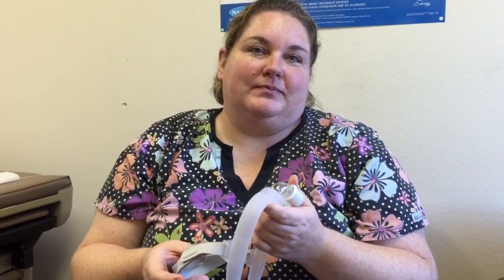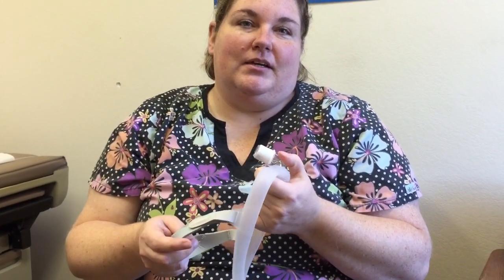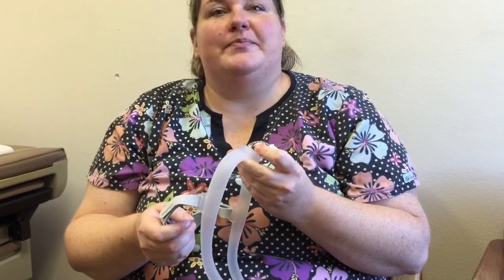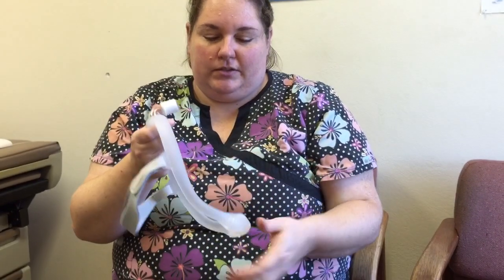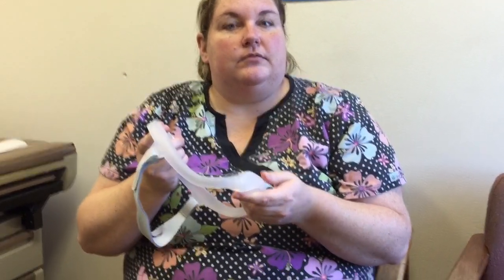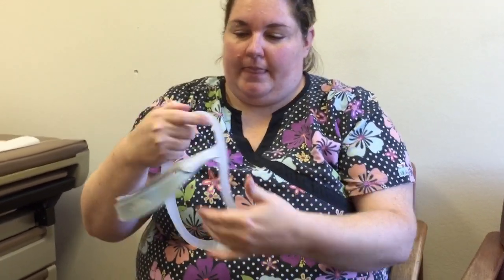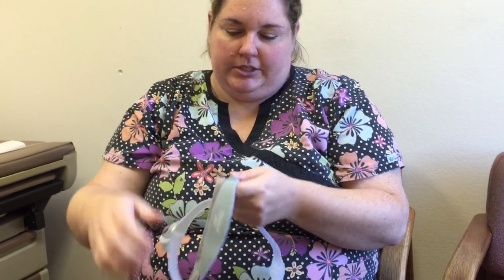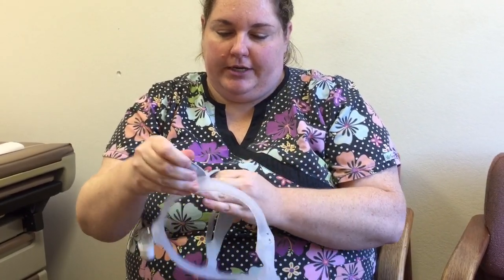Mouth opening was not an issue, just as it wasn't with the Polaro. Kim tried the medium headgear frame, and it worked well. The headgear comes in small, medium, and large. The nasal pillows come in small, medium, medium wide, and large. The strap that hooks on your head is adjustable to fit.